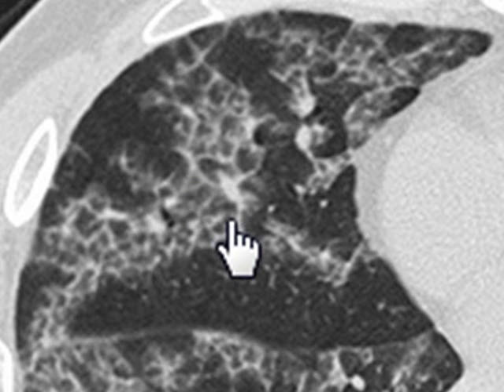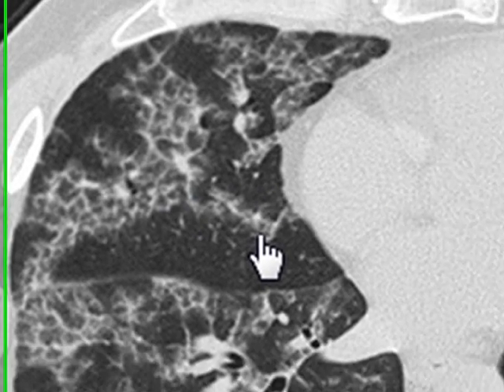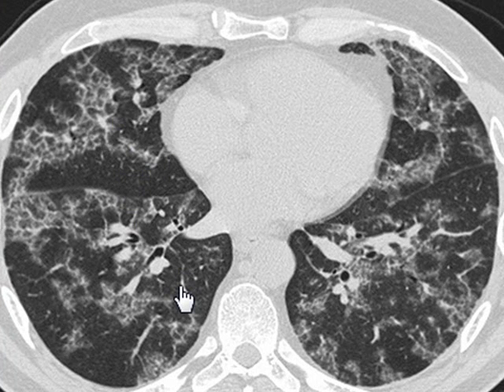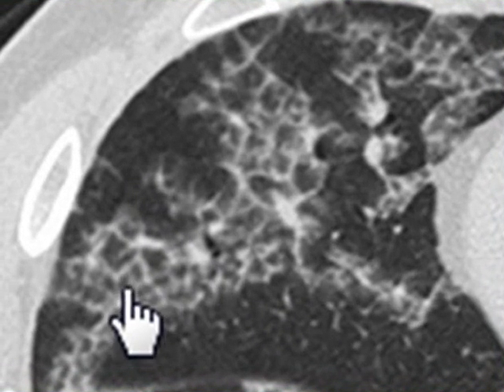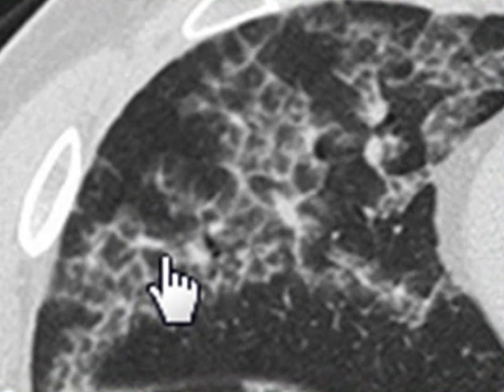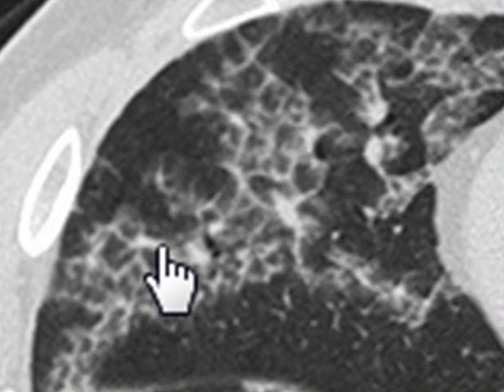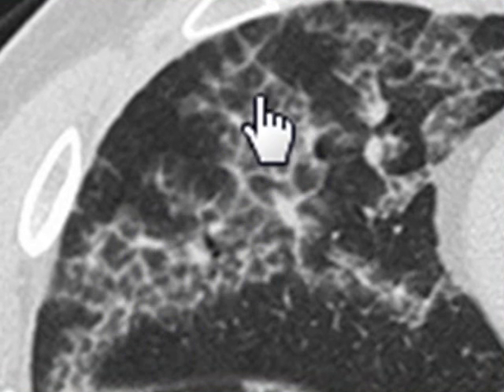Whenever you see prominent interlobular septa, it means a patient is suffering from a condition involving the interstitium rather than the alveoli. However, many such conditions eventually involve the alveoli as well, either as a direct or indirect effect. You can see some thickened lines that are creating a polyhedral shape — the structure surrounded by this pattern is a secondary pulmonary lobule, and we can identify a number of them in this area.